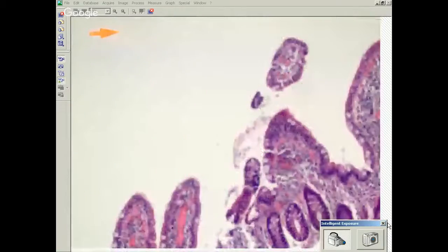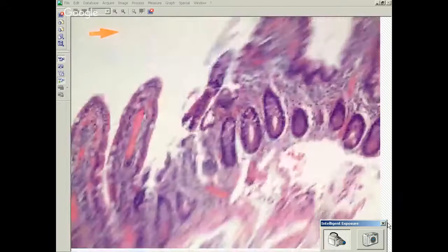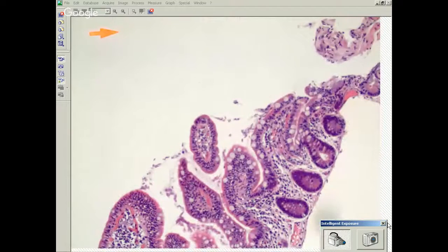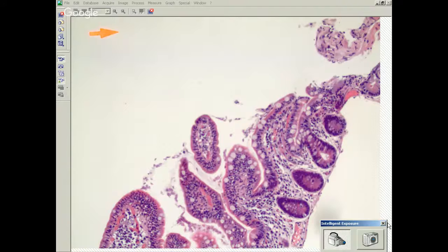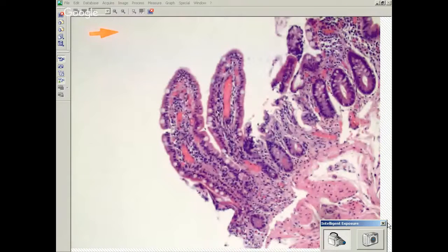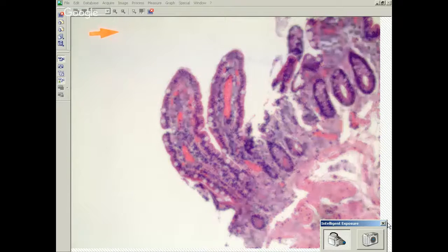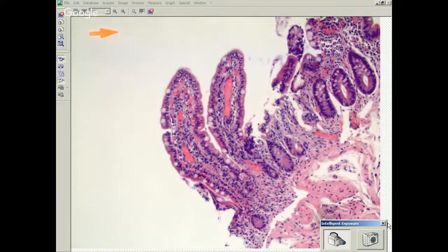How do we know it's not duodenum? Yeah, there are no Brunner glands, right? But patients can have a Giardia infection in the ileum as well. It's just less likely. So it's more likely to happen in the duodenum. It happens in children and also in young adults, so patients in their 20s and 30s. It also has a peak during late summer and early fall. I think it's probably when people are camping, drinking water that's probably not that clean.